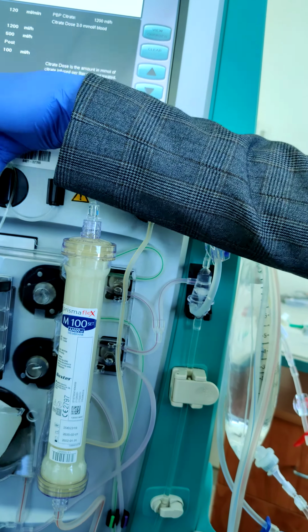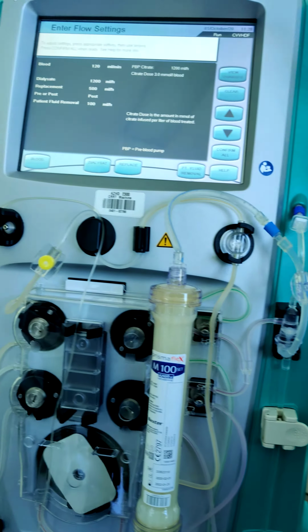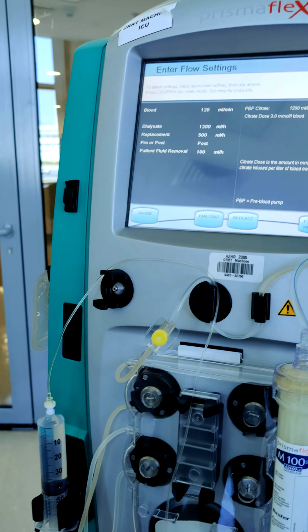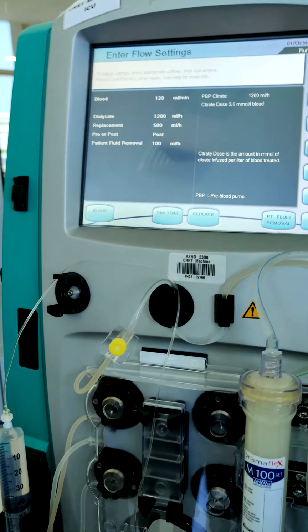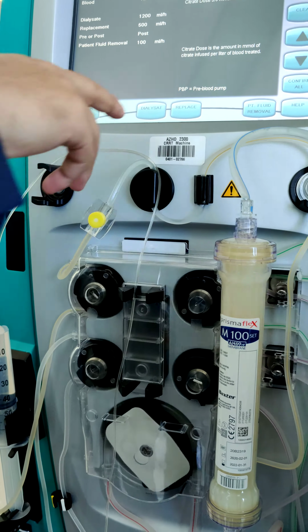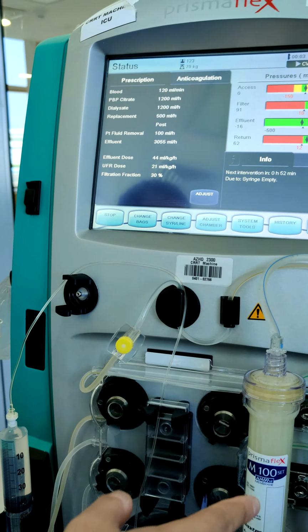Why? Because this is citrate. Once you change the blood flow, the pre-blood pump will automatically increase. It should be 10 times the blood flow. I mean, it is fixed according to the blood flow. Now the machine is giving the calcium to the patient automatically, 100%, according to the composition, without checking the dose of the calcium in the patient and the post filter.